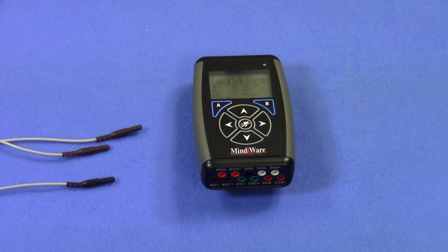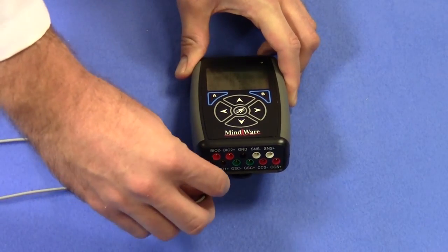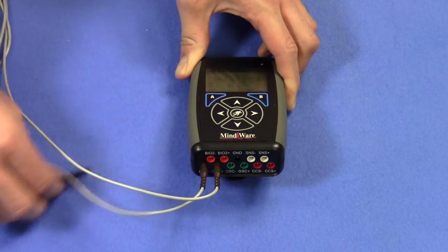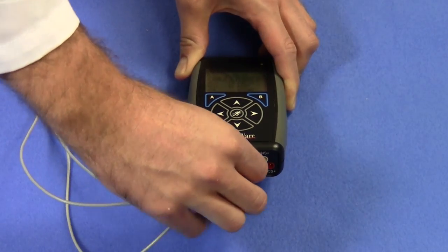Once the electrodes have been placed, the leads can be plugged into the data acquisition device, such as the MyWare Mobile. You can see the lead colors I chose correspond with the channel that I'm using. It's important to note that the negative ECG electrode is on the collarbone while the positive is on the lower left rib. Plugging these in backwards will lead to an inverted signal which, while can be easily dealt with in the analysis applications, is not ideal.